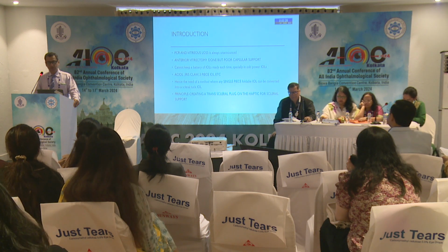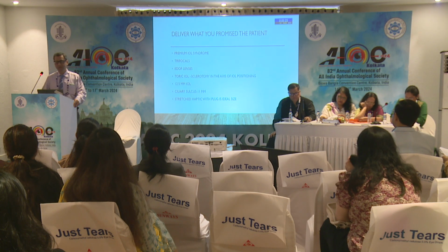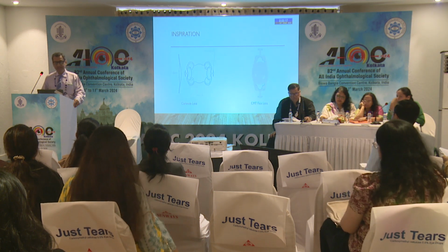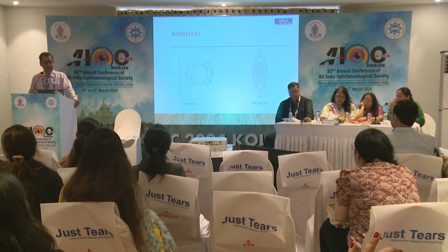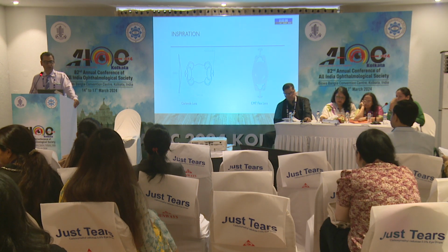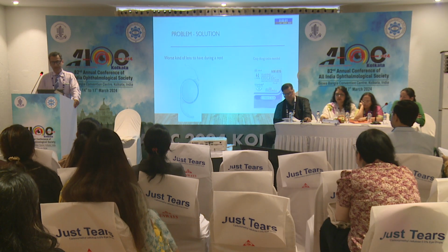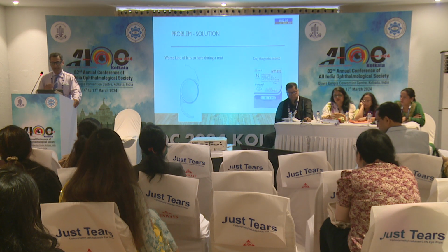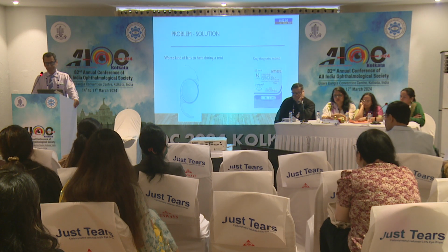The principle is creating a transscleral plug on a haptic for scleral support, so you can deliver to your patients what you promised: a premium IOL, trifocals, EDOFs. This is the inspiration for the thought I had in my mind: the Carlevale lens, which has a transscleral plug that holds the IOL in position in patients with a deficient posterior capsule, and the CMT flex lens which is available in the market. This is the worst kind of situation, where you can't put the lens in the sulcus. The only extra thing you need is a 4-0, 5-0 or 6-0 Prolene suture.